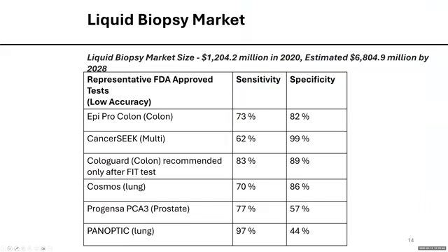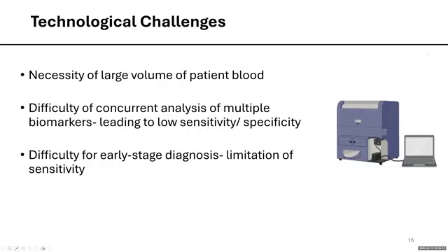The market share of liquid biopsy technology is growing exponentially, but currently very few tests have been approved by FDA. And you can see from this table that these tests are mostly for one single cancer, and they either have very low sensitivity or low specificity. So use of these tests currently is only limited as a companion diagnostic test.